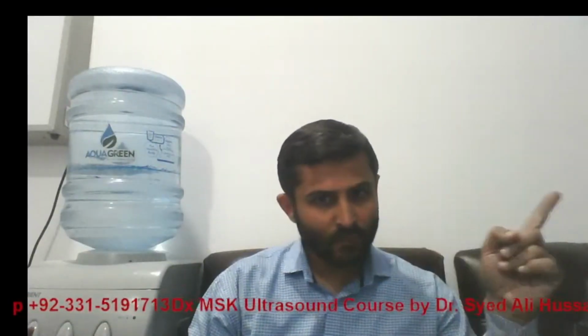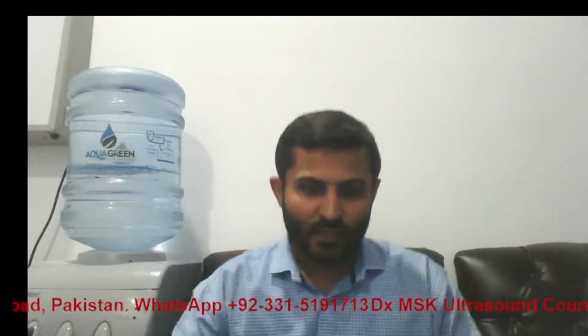So the bone will be the brightest structure that you will see in ultrasound, number one, metal and bone. Secondly, there will be posterior acoustic shadowing. I will not go into the detail, but you will see the image and understand what is meant. Posterior means posterior to the bone, acoustic means the sound waves, and shadowing means blackness. So past the bone, you will see a black area.